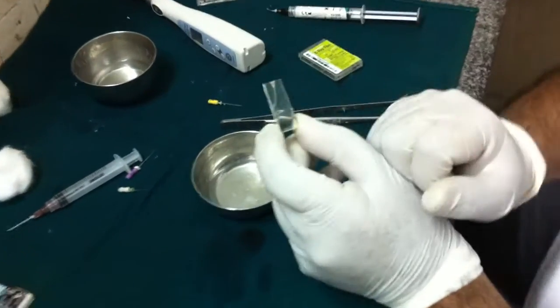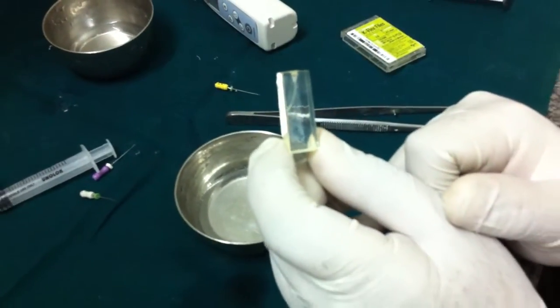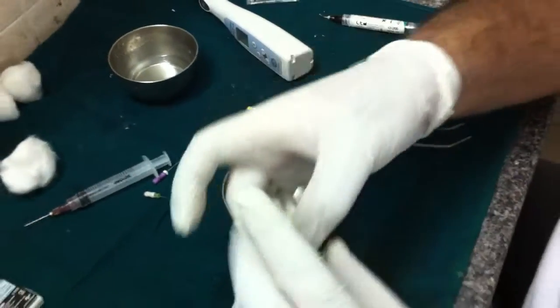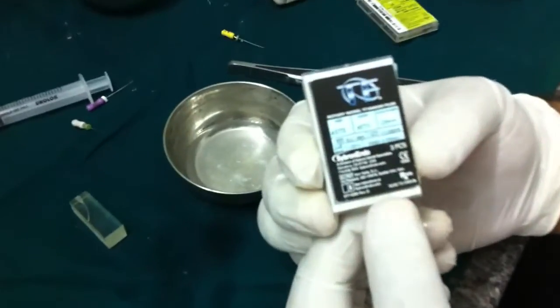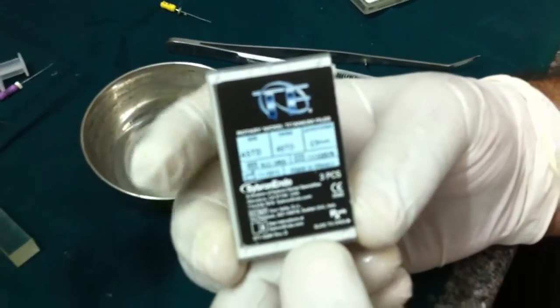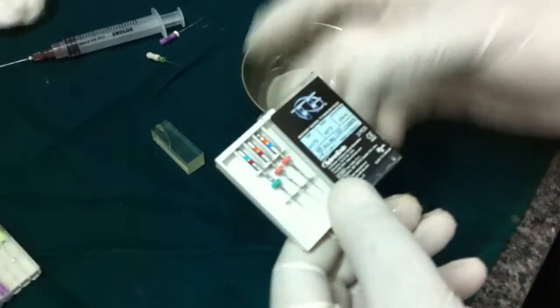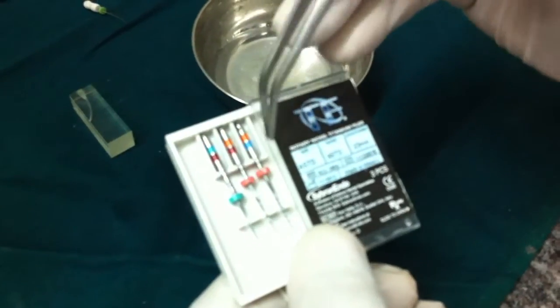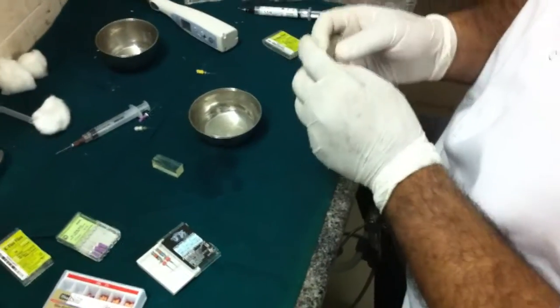Now, this is following patency, orifice enlargement and glide path. Now you start with your rotary. This is the twisted file assorted kit. When you open it, you have three files: the 25 8% taper, the 25 6% taper and the 30 6% taper. So you start with the first file, that is the 25 8% taper.